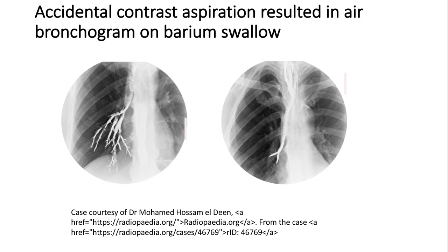Okay, so these are the images I just showed you. This is called accidental contrast aspiration resulting in air bronchogram on a barium swallow.